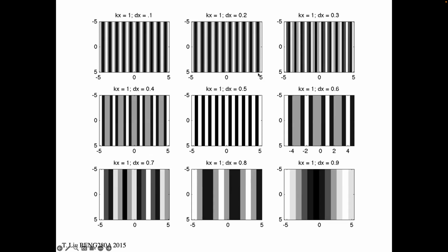So here's a visual example. I like this example for demonstrating aliasing. Here we have in the plane a sine wave, actually a cosine, going in the x direction, we'll say. And let's call this 5 millimeters. So I have 1 cycle per millimeter here is what it looks like. And my sampling rate to generate this picture was 1 sample every 1/10 of a millimeter. So I got 10 samples between here and here, or 50 samples between here and here, right? So they're pretty close together. I get 10 samples per sine wave. That should be high enough to sample that sine wave adequately, right?